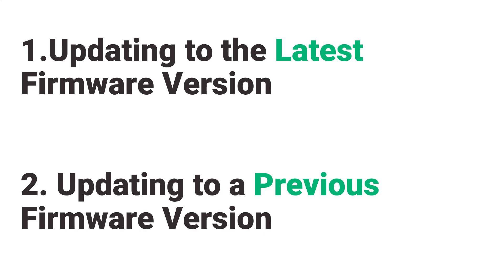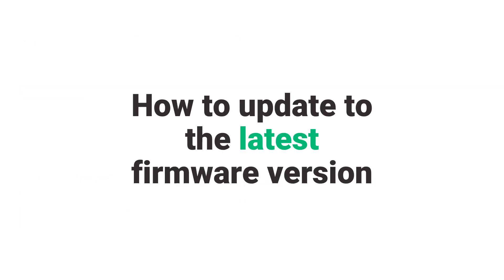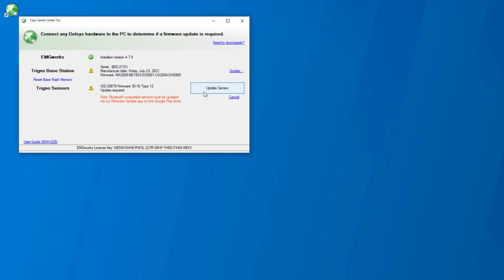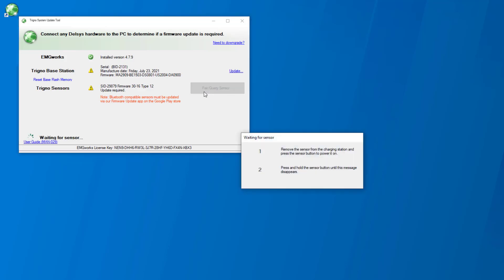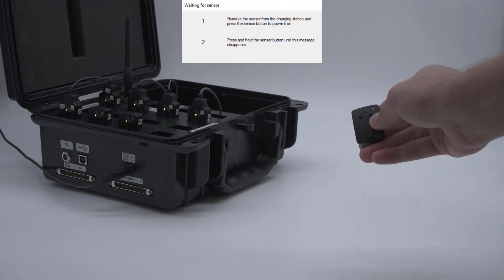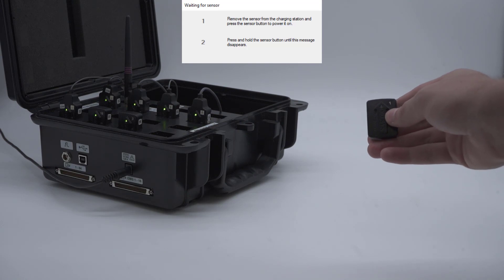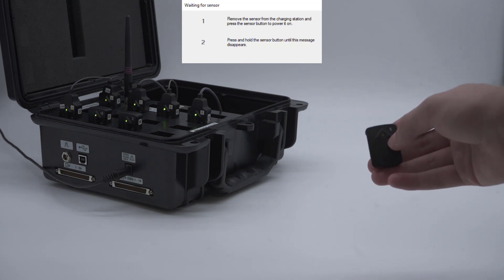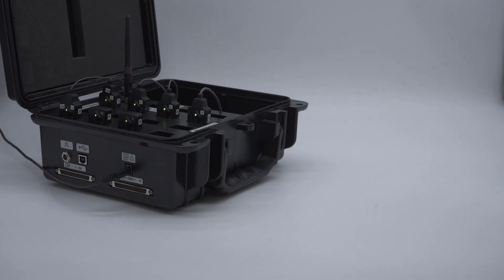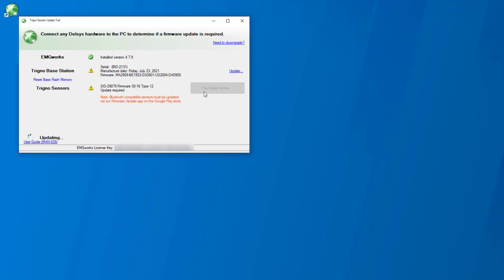How to update to the latest firmware version: To begin, select update sensor in the Trigno sensor section. Skip step one of the on-screen prompt if the sensor is flashing between green and amber. Follow step two by holding the sensor button down until the prompt disappears. The status will appear in the bottom left-hand corner of the tool.